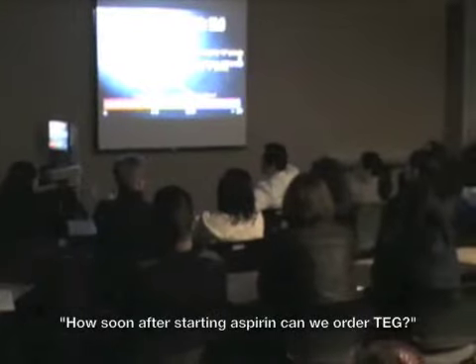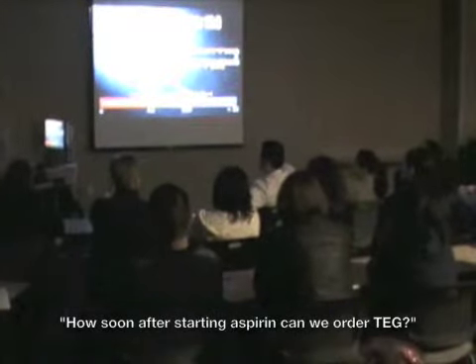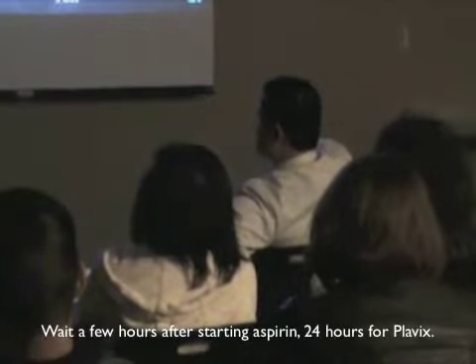So TEG is a primary test. TEG is a very good tool to use. Yes, sir. You have to order it. All my patients need TEG. How long do you wait before you do another test to see whether or not they're sensitive to it? A couple hours. Oh, wow. Yeah. Really? Yeah, we'll see.